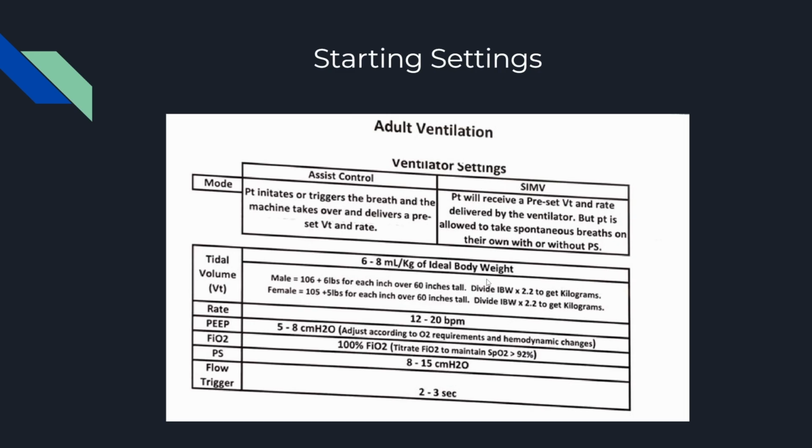Okay, I'm a big guy. I weigh about 150 kilos. However, if you give me enough volume for a 150 kilo person, you will pop my lungs. So you need to do the calculation. Luckily, Tony's gone ahead and put the calculation right here.